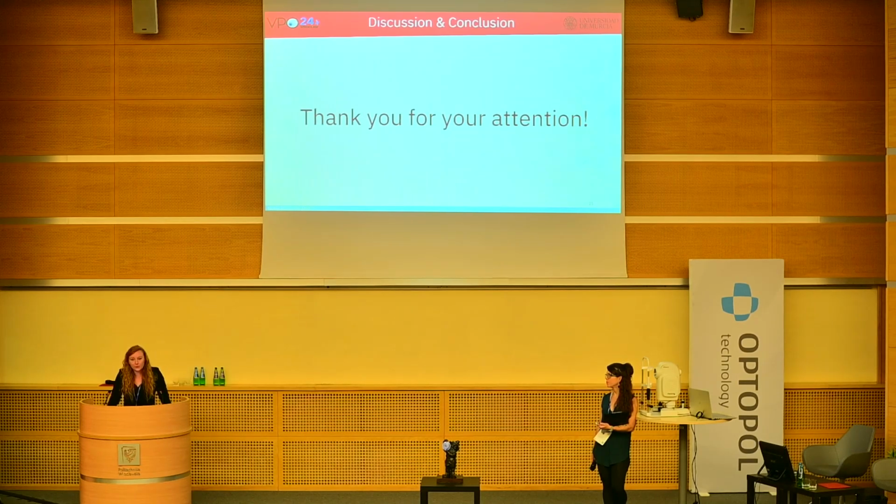Well, I did not use the full range, since the telescope is in the way. The shadow of the telescope makes a black round in the thermal imaging. So in that case, I'm not using the full range of the temperature.